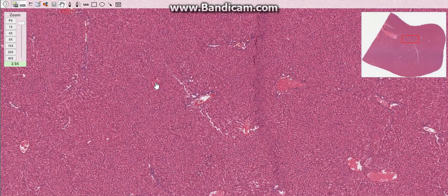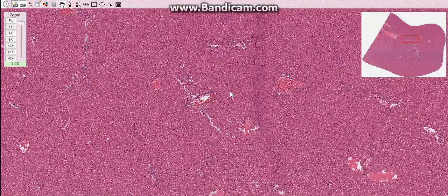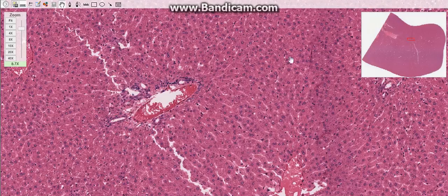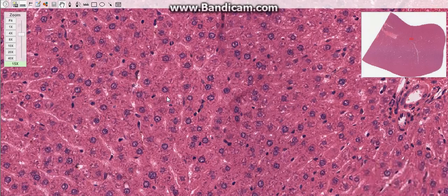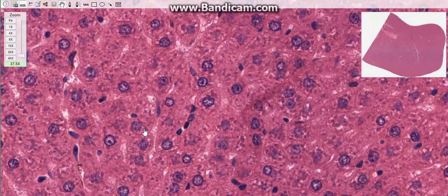So right now, I think we have talked about three types of lobules and the structural unit of the liver, as you can see here. And there is also a very important type of cells. These are the Kupffer cells, or liver macrophages. But that is going to be in the sinusoidal lining cells. They are cells that constitute the defense system of the liver. But that is going to be in a separate video.